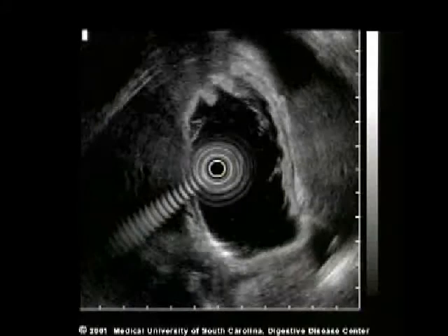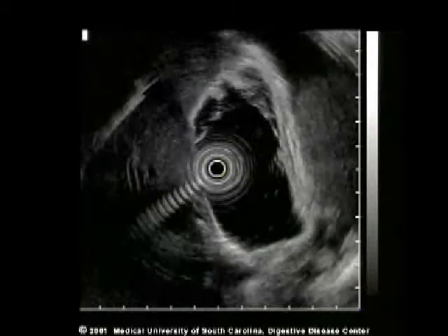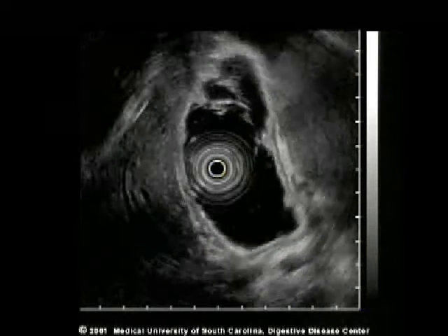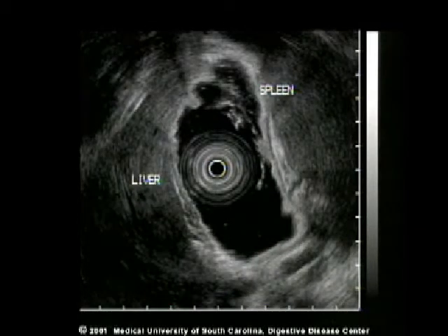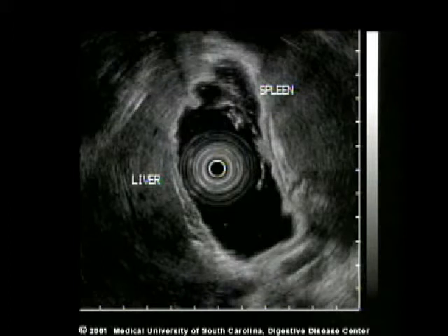Splenomegaly is also easily identified. Normally the spleen is considerably smaller than the liver. In this case, with the transducer in the mid-stomach, a very large spleen is seen on the right-hand side of the screen.